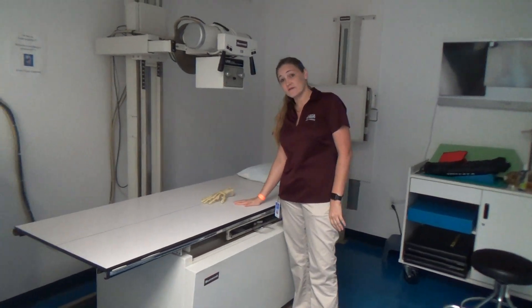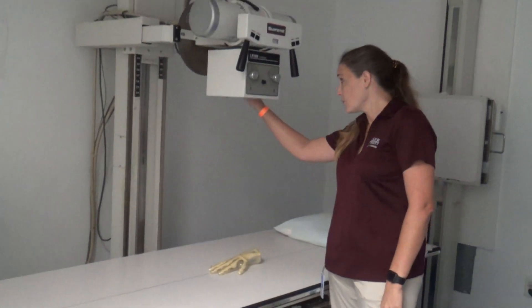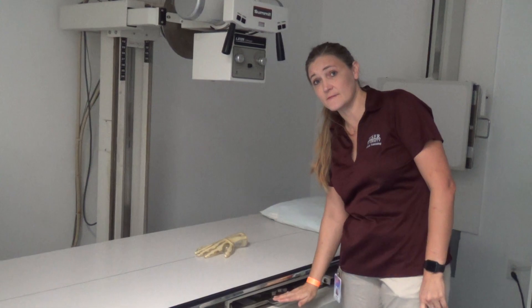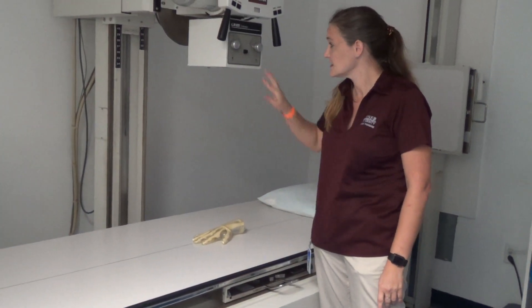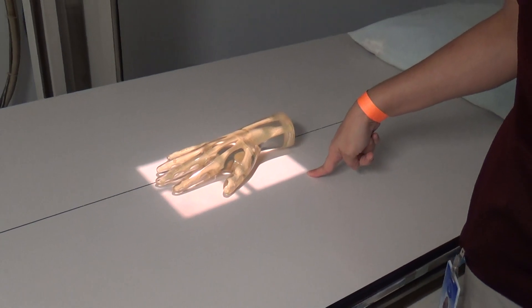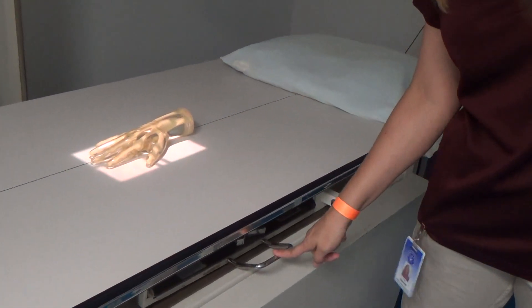So I've got this patient positioned on the digital side. Some differences between this side and the other side. One is my distance — I'm still at 40 inches, but I no longer have my film on the tabletop. I'm now here in the Bucky. So you have to make sure that your distance is showing 40 on the cassette. I've got my central ray lined up with the center of my body part.